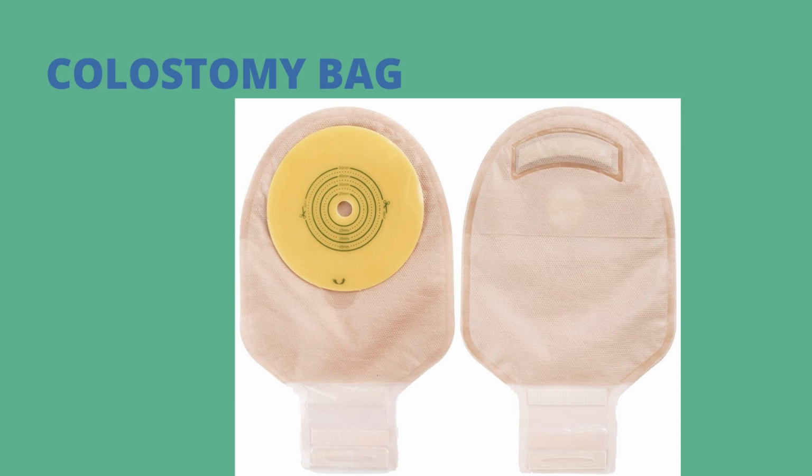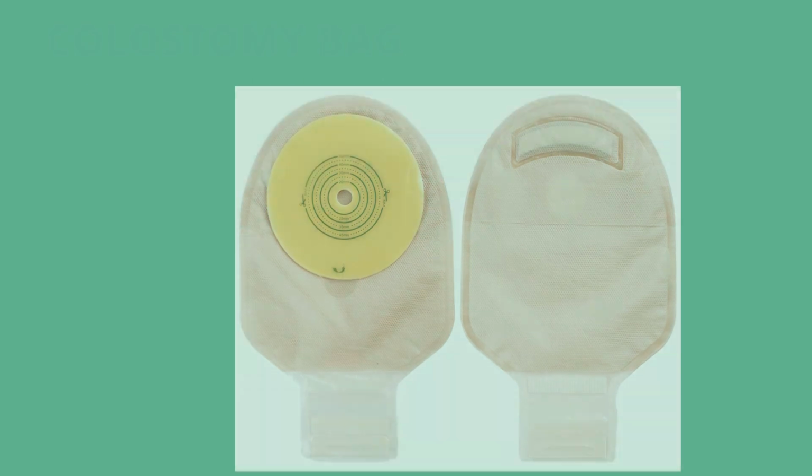The range of this colostomy bag price is, I think, from 600 or 700 up to 1500. The duration of use of this bag is, I think, 1 to 3 days. Within these 3 days we need to discard this bag. So use it very carefully. Okay, next.